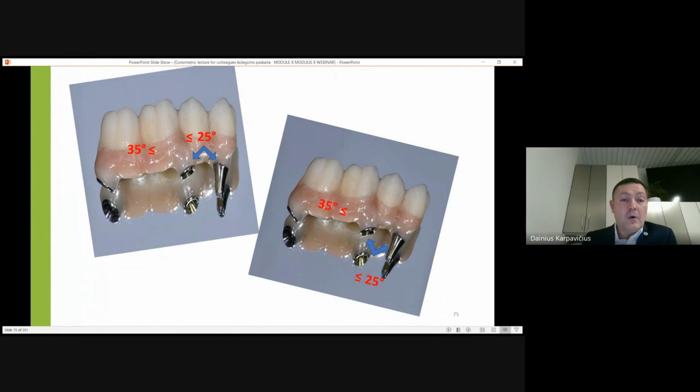So knowing a couple of numbers of the accessories of the prosthetic solutions gives you more freedom. Sometimes after our lecturing, a doctor says, no, when we hear this technical description from anybody... Maybe for me it is easier because I am also connected with engineers in the factory, and knowing these numbers, I share them with doctors.